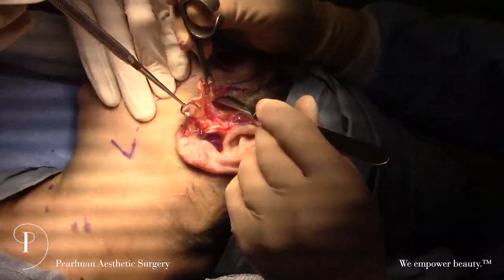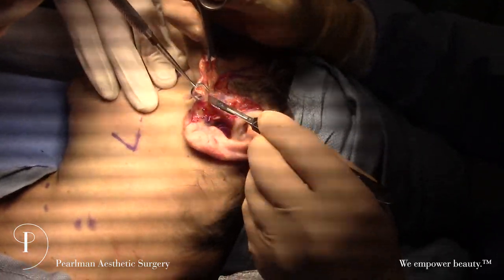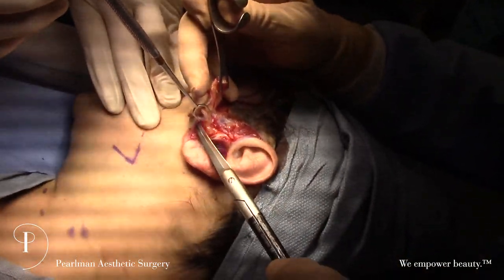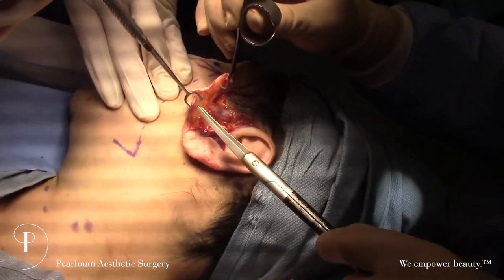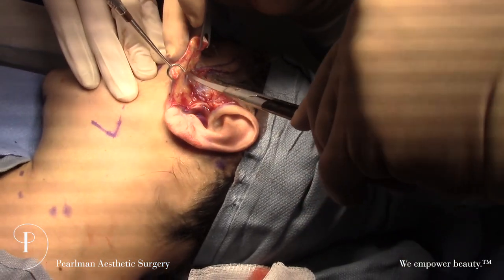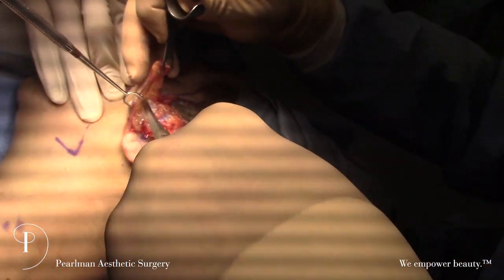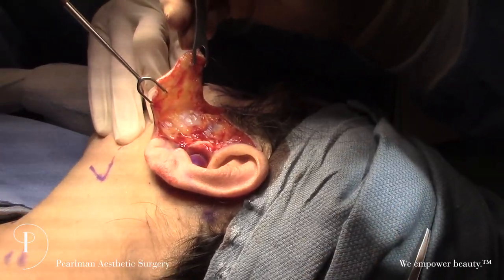We've lifted up the beginning with the scalpel, staying right under the skin in that fat layer. Now changing to the facelift scissor and starting to lift just underneath here. I tilt my head down and I can actually see the light shining through the skin — that's how I know we're at the perfect layer. We have one light over my shoulder and one from the other side aimed at the skin, so when I go down here you're going to see it transilluminate — that yellowish color tells me we're in the perfect plane.